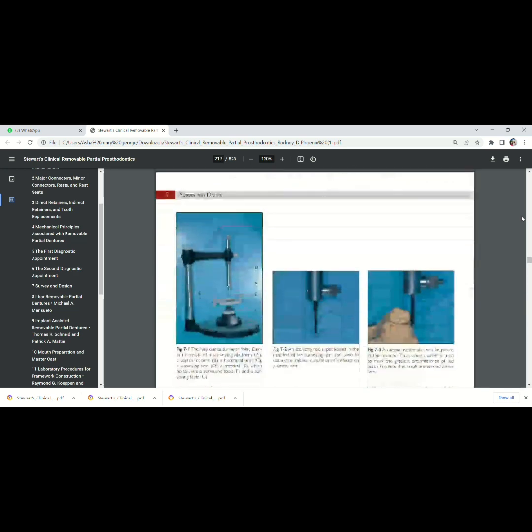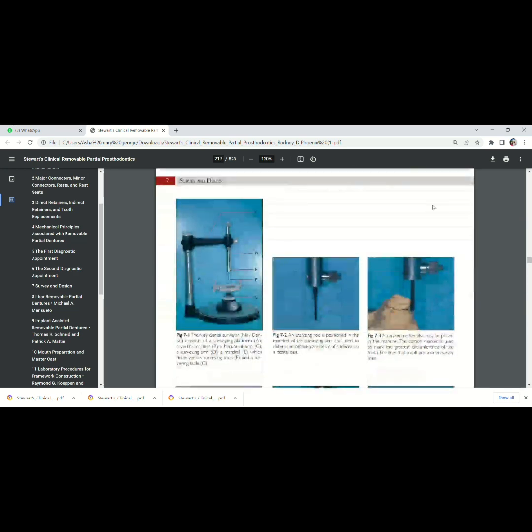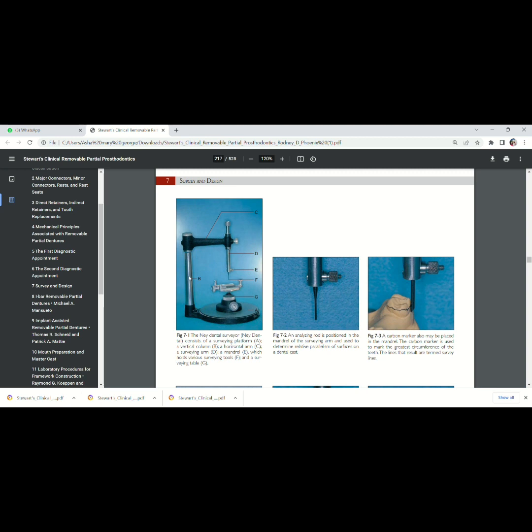So this is the Dental Surveyor, the knee Dental Surveyor. You can see there is a vertical arm, then horizontal arm, then a surveying arm.